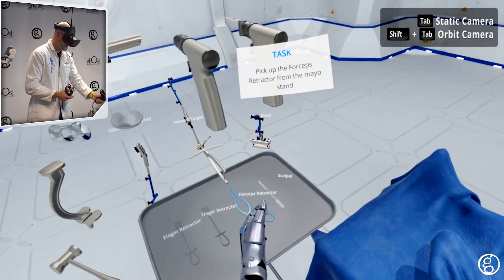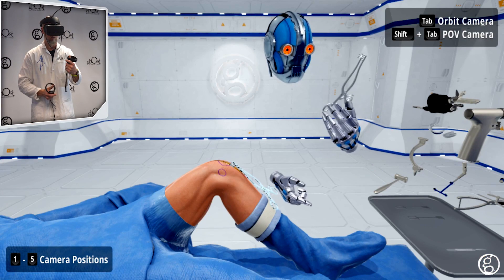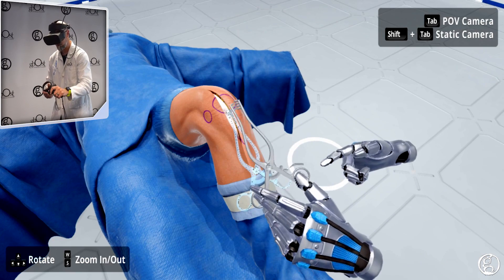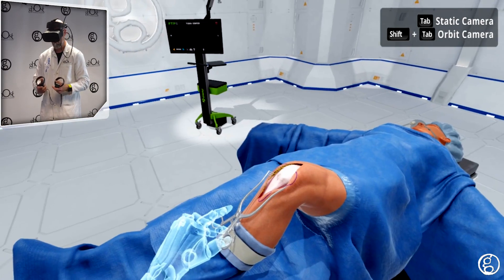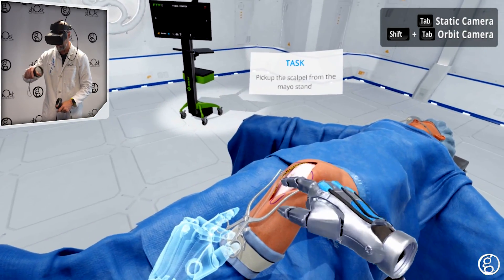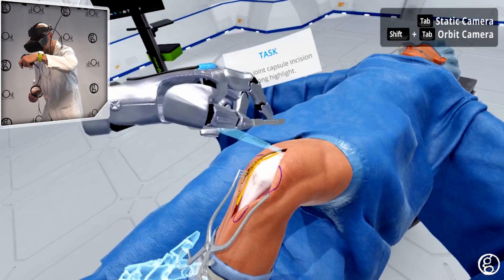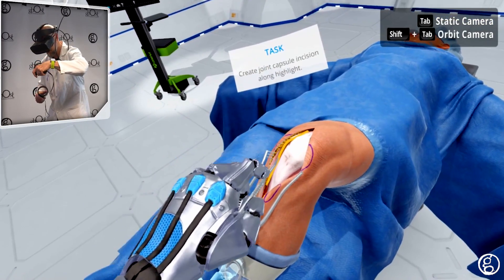I also have a few tools on the Mayo stand I can use to manipulate the soft tissue — finger retractors. For this demo, I'm going to use these forceps retractors. They're fully functional; I can squeeze them and open them up. So I'm going to place them in the incision and retract it. I'll select the scalpel from the Mayo stand. Now I'm ready to make the incision through the joint capsule to gain access to the joint space. I'll grab the scalpel again and use the highlight as a guide.